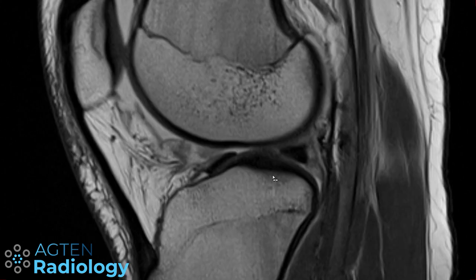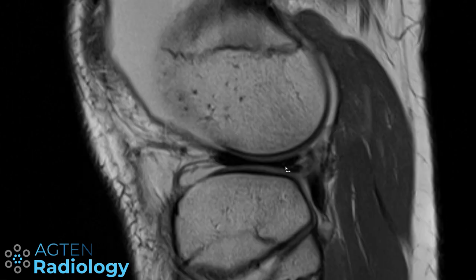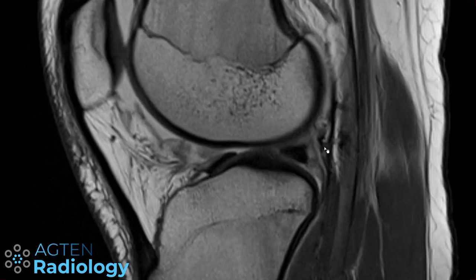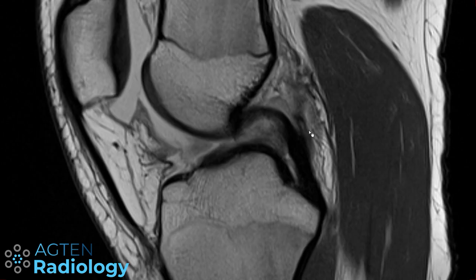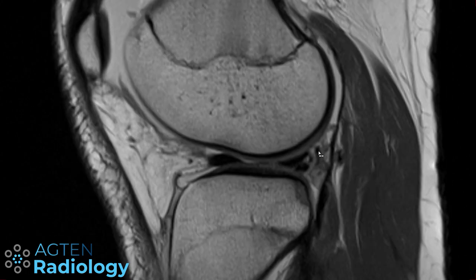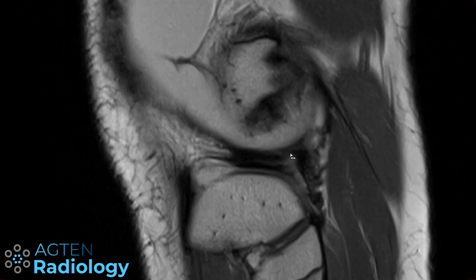And if we scroll over to the lateral compartment, you can see yet another variation or form of a posterior horn lesion. And this is this one here. First of all, we have some kind of a complex tear of the meniscus here, but follow this structure here. So this is the Wrisberg ligament running just behind the PCL here. So this is the Wrisberg ligament. And at some point it should connect to the base of the posterior horn. And here we can follow it on and on and on, and it might only go back to the meniscus substance at this level very peripherally.